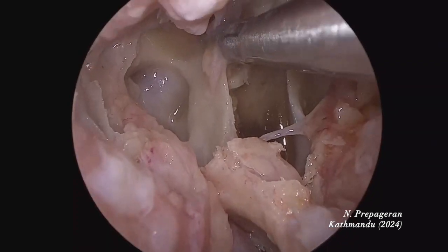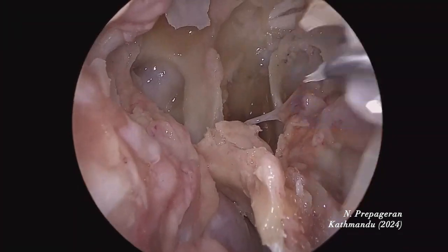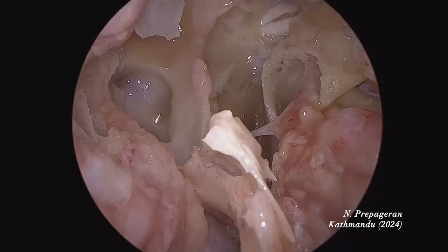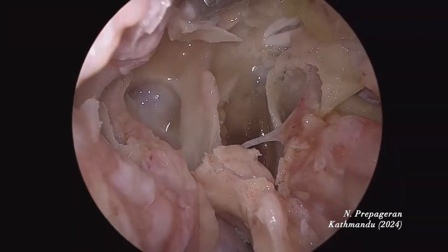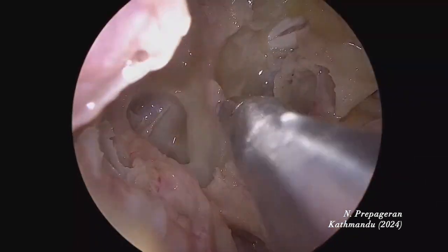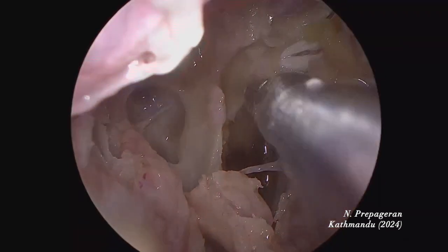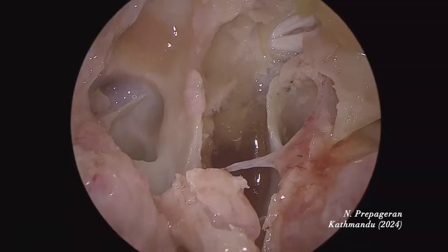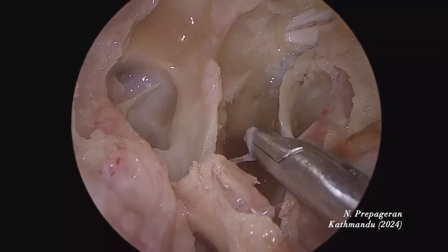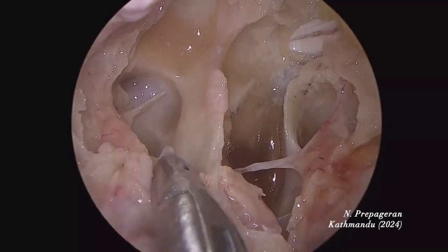It's important to make sure the planum is exposed as well — the one above the sella. From the anterior wall of the sphenoid sinus downwards, that's the optic-carotid recess on the right side and the optic-carotid recess on the other side. This is not a classical sphenoid sinus because you have multiple septa here — a septa here, a septa here, and another one here.